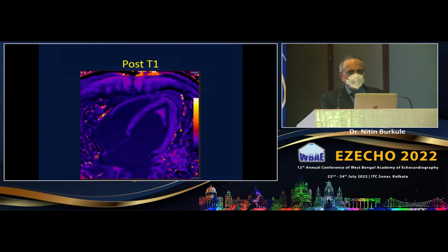And again preserved T1 values here, because there is no GAD going inside. So I have a clot here with a heme inside. At the boundary I have got an endothelial injury, and then there is a normal myocardium, no infarct, normal myocardium.